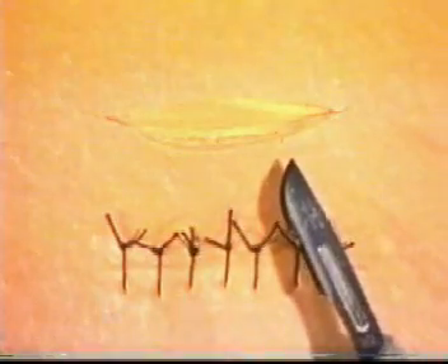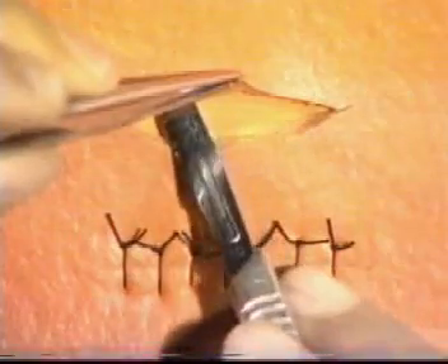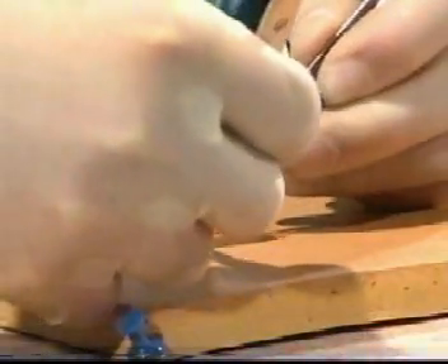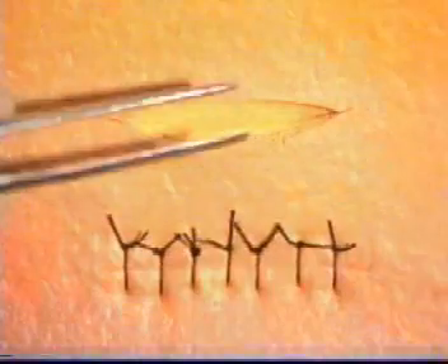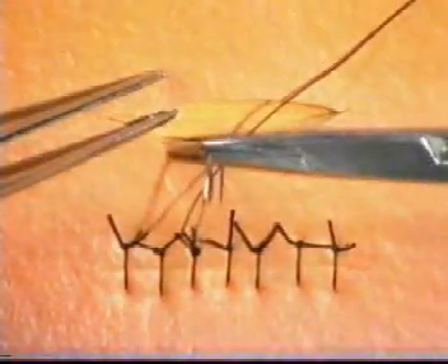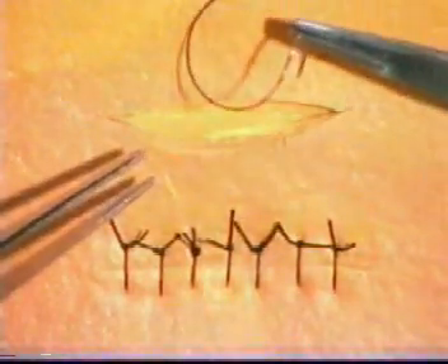Having completed that suture, halve the remaining wound and continue as shown. It may not be possible to do this for an elliptical incision, and you may need to undermine the incision edges to increase mobility of the skin edge. In this situation, it is not practical to start in the middle of the wound, as such a suture will be under too much tension and therefore inaccurate.